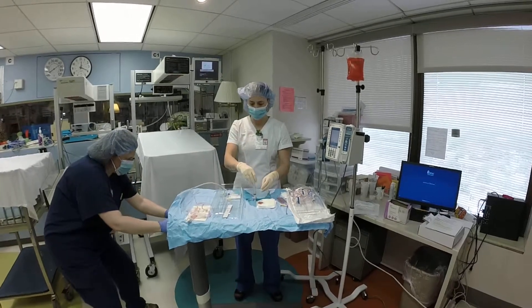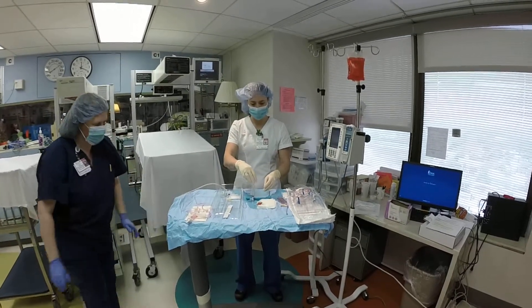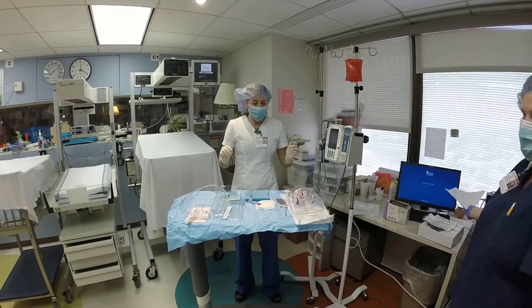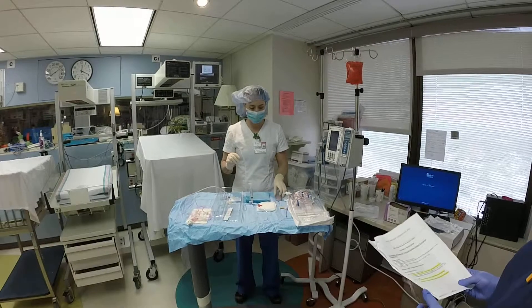You want to remember to be sterile when you're setting things up, and you'll need to get your own set of gloves, because the ones that come in the package contain latex.